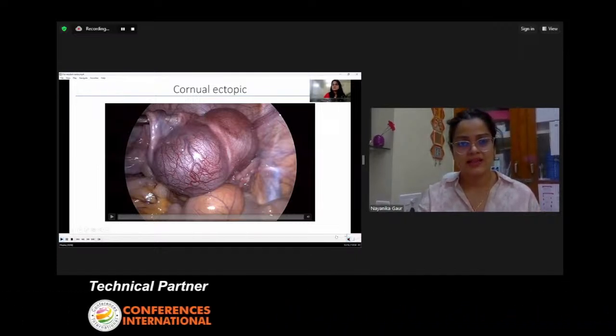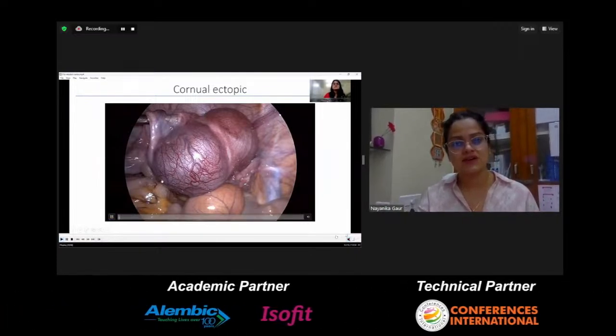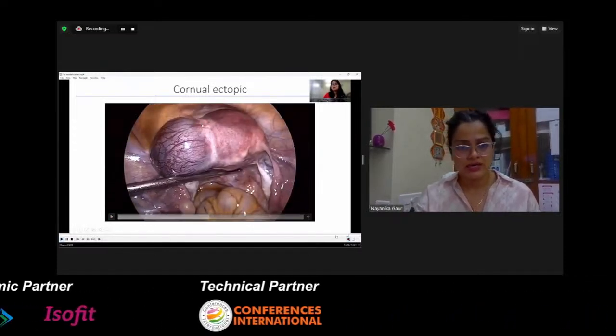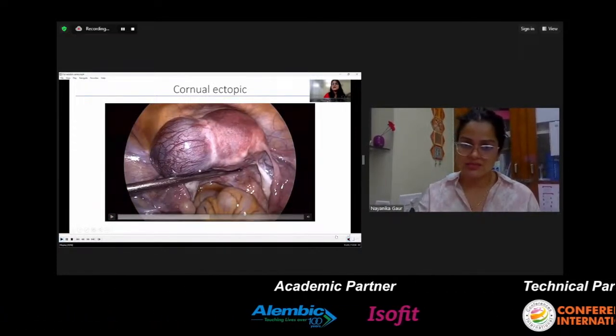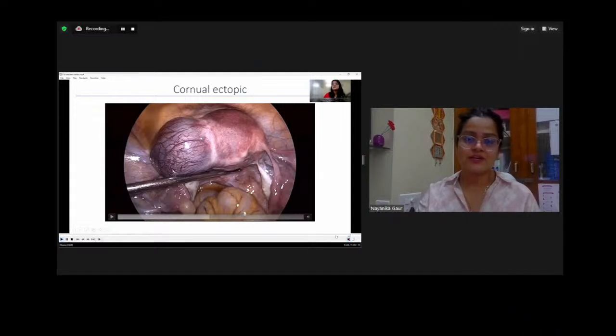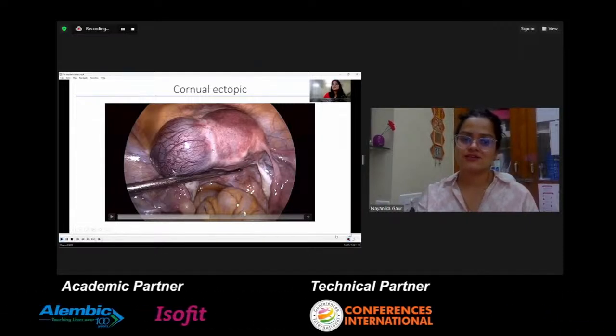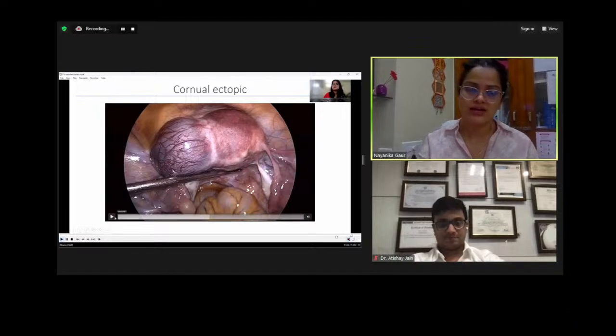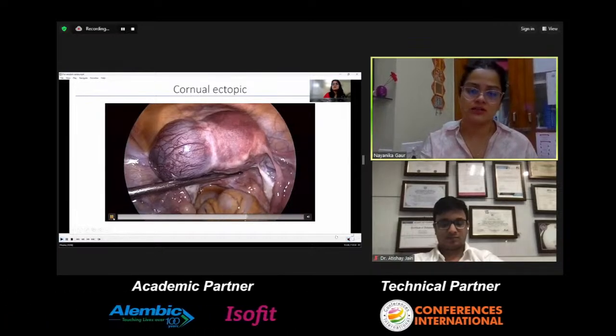Now, this is actually the case of a cornual ectopic pregnancy, where you can see this ridge in the middle, and there's this huge bulge. The reason why it is becoming this huge bulge is because there is myometrium also around it, right? So therefore, this pregnancy became this big. And here, this ridge is actually the one which shows that there is a possibility that it's more of a cornual ectopic than actually in the tube.